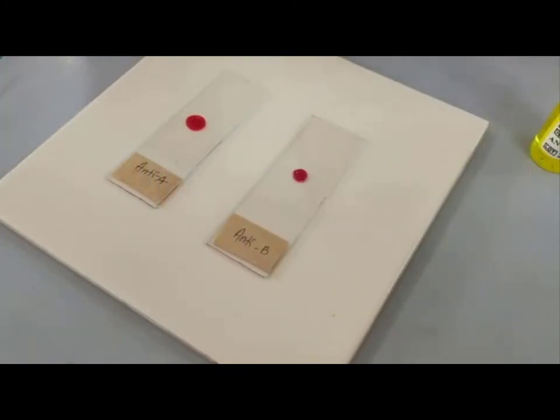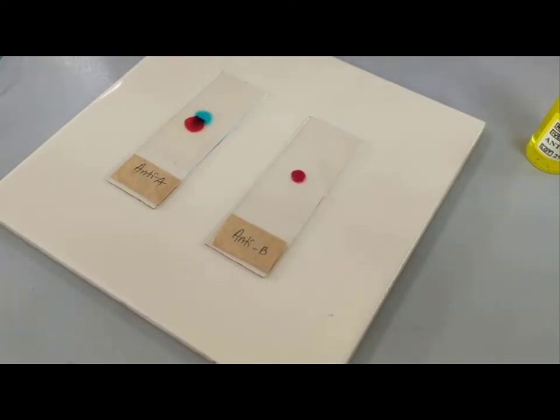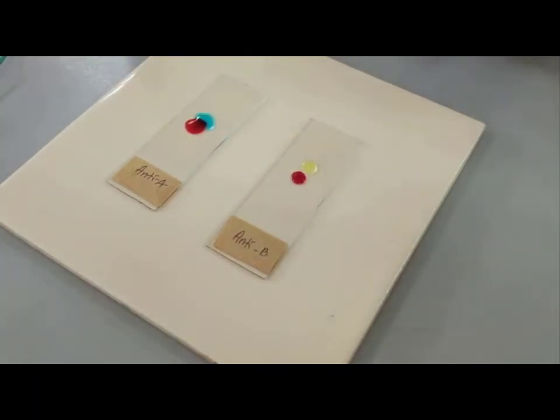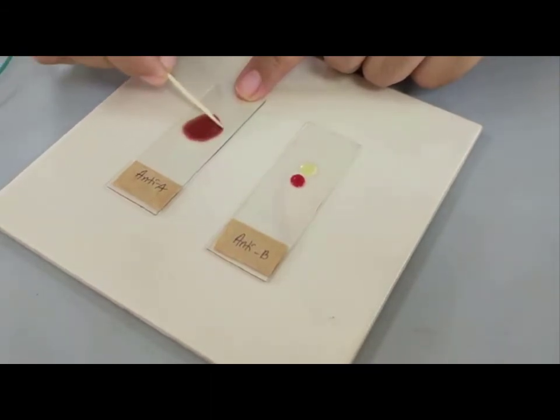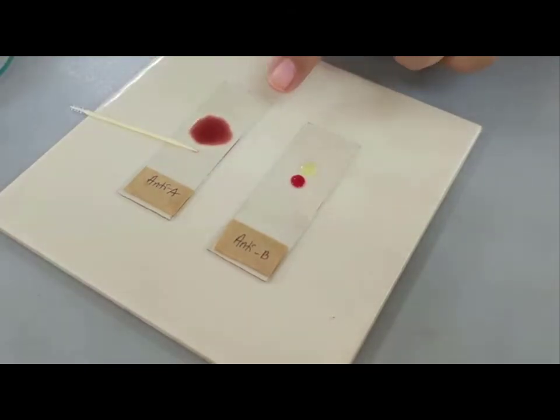For the next procedure, you will drop anti-A serum near the blood on slide 1, and then anti-B serum near the blood on slide 2. Now, use the sharp end of a toothpick and mix the blood with the serum. Make sure to use a different toothpick for each slide.